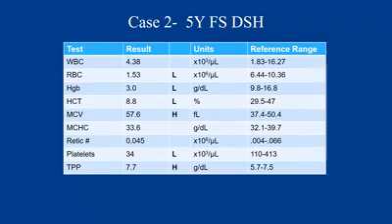Our limited hematology data that I'm going to show you first. We have a white cell count that was within reference interval, so 4,380, okay? Our red cell parameters, so red cell count, hemoglobin, and hematocrit are all notably decreased, so we have a marked anemia in this patient.